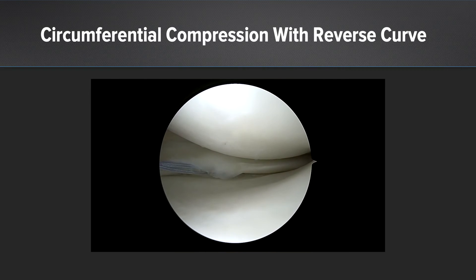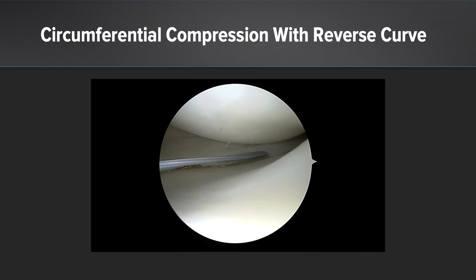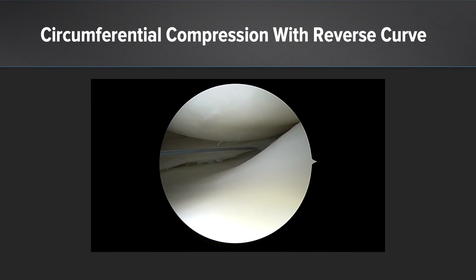For this tear, which extends all the way to the roots, we'll add a third repair device, staying on the inferior aspect of the meniscus. You can see really nice tensioning with the fiber stitch, and we get a nice anatomic construct with great circumferential compression around the entire meniscus.